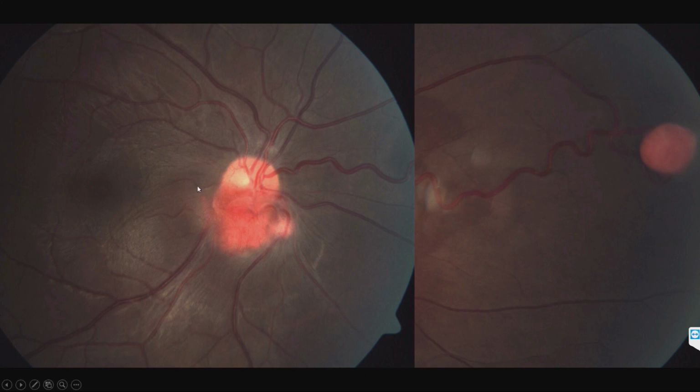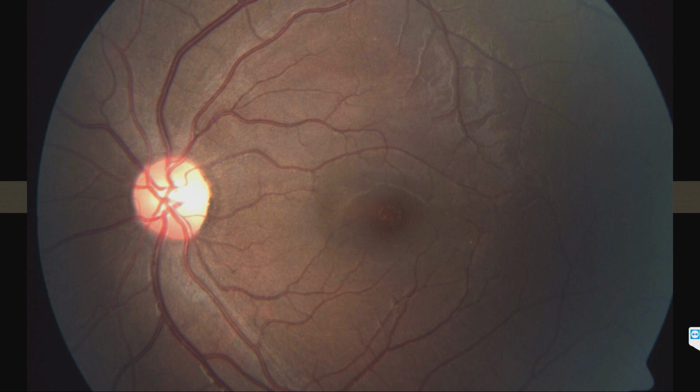The disc in the right eye showed a reddish orangish lesion, which was occupying the inferior half of the disc with obscuration of the margins. The upper half of the disc appeared normal, and there was a dilated tortuous vein going to the temporal periphery, which ended in a lesion about 3/4 disc diameter in size, about the same color, with a feeding arteriole. That appearance is very typical of retinal angioma in a VHL patient. In the left eye, clinically we couldn't see any angiomas, either in the posterior pole or in the periphery.